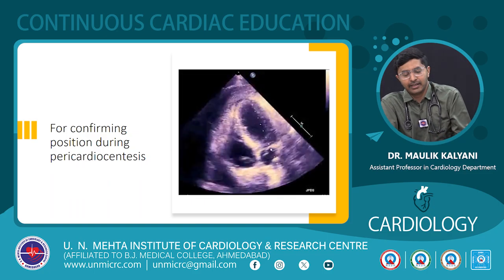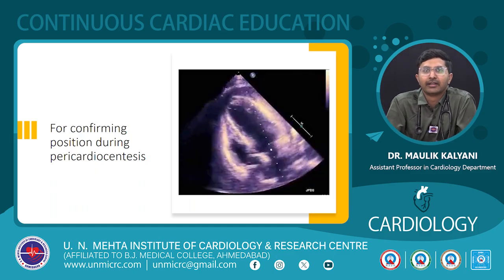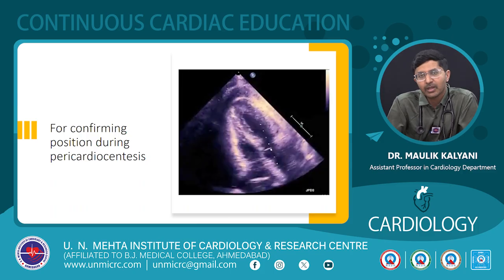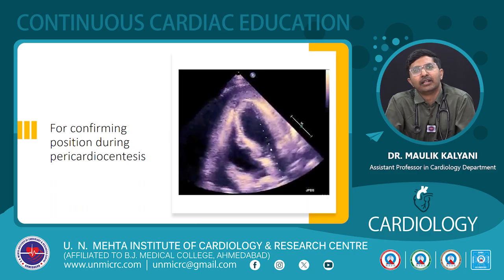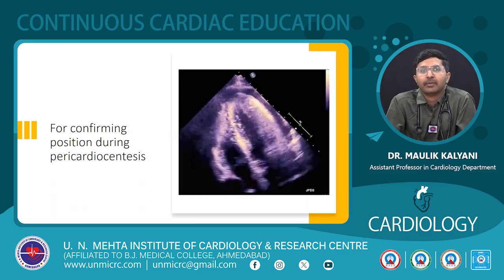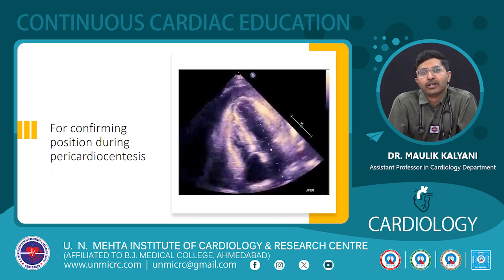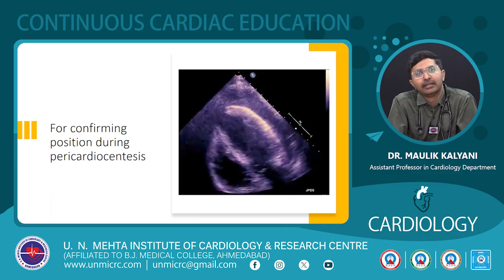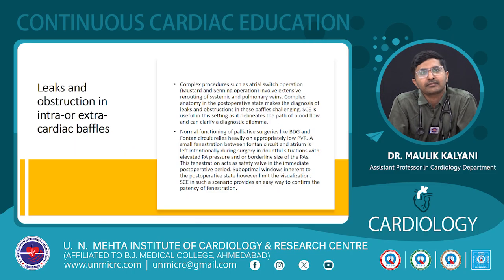Because the pricking needle, even though large bore, many times even if you rupture the ventricle, might not result in further perforation and massive blood loss. But if you dilate it with a 6 French or 5 French sheath, it might lead to a cardiac rupture, and the patient might not be savable at all. So in this video we can already see contrast appearing in the pericardium, and so we can safely insert the guide wire and do pericardiocentesis from there.